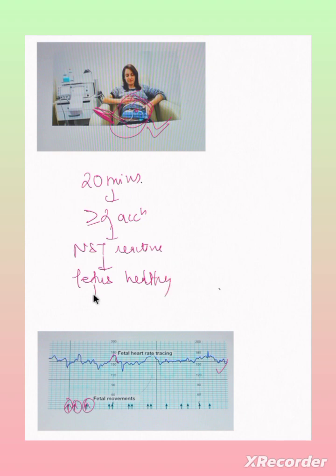Now in a period of 20 minutes, if I'm getting more than or equal to 2 accelerations, that means NST is reactive. NST is reactive, that means the fetus is healthy, and you can send the patient back to her home.